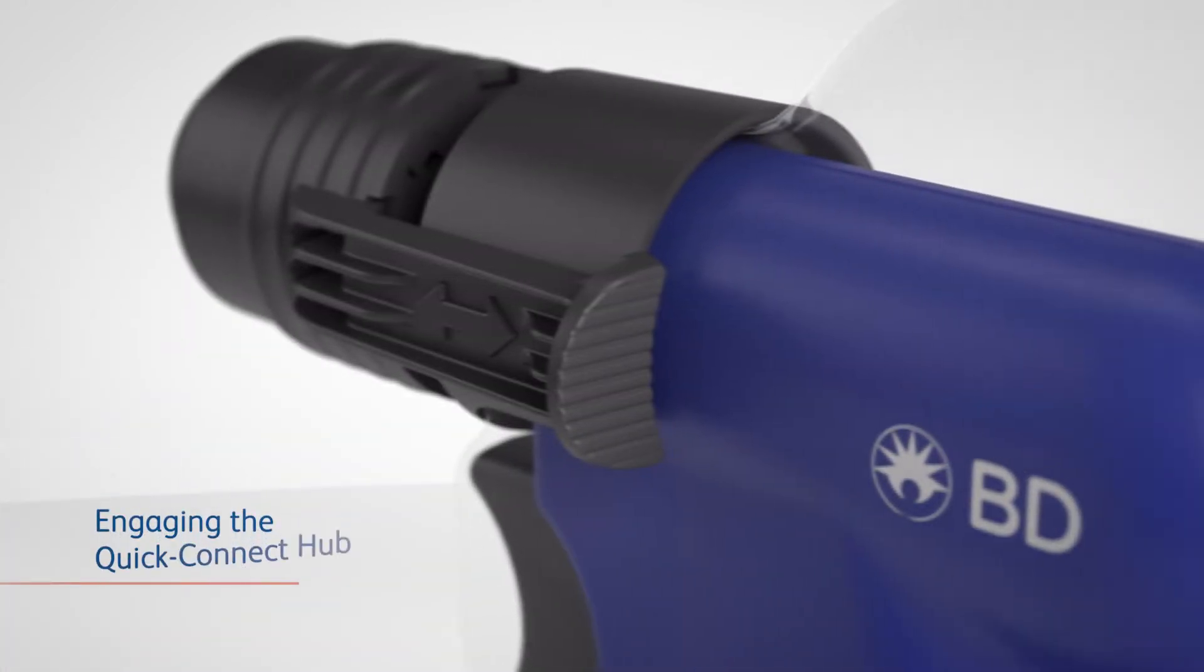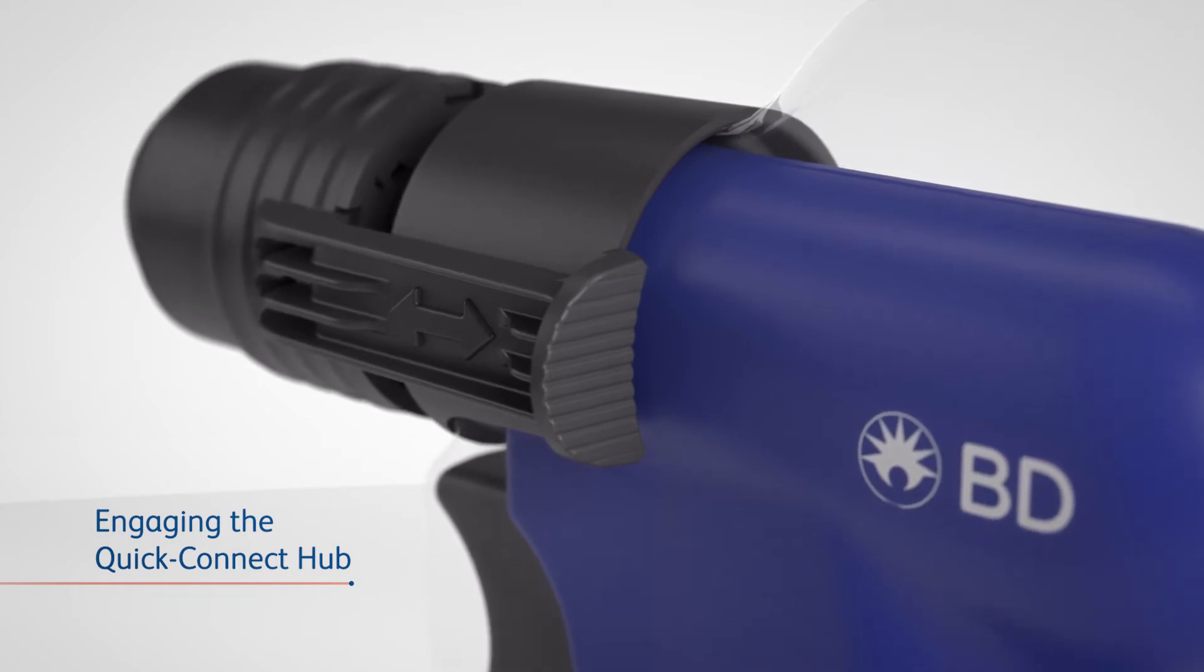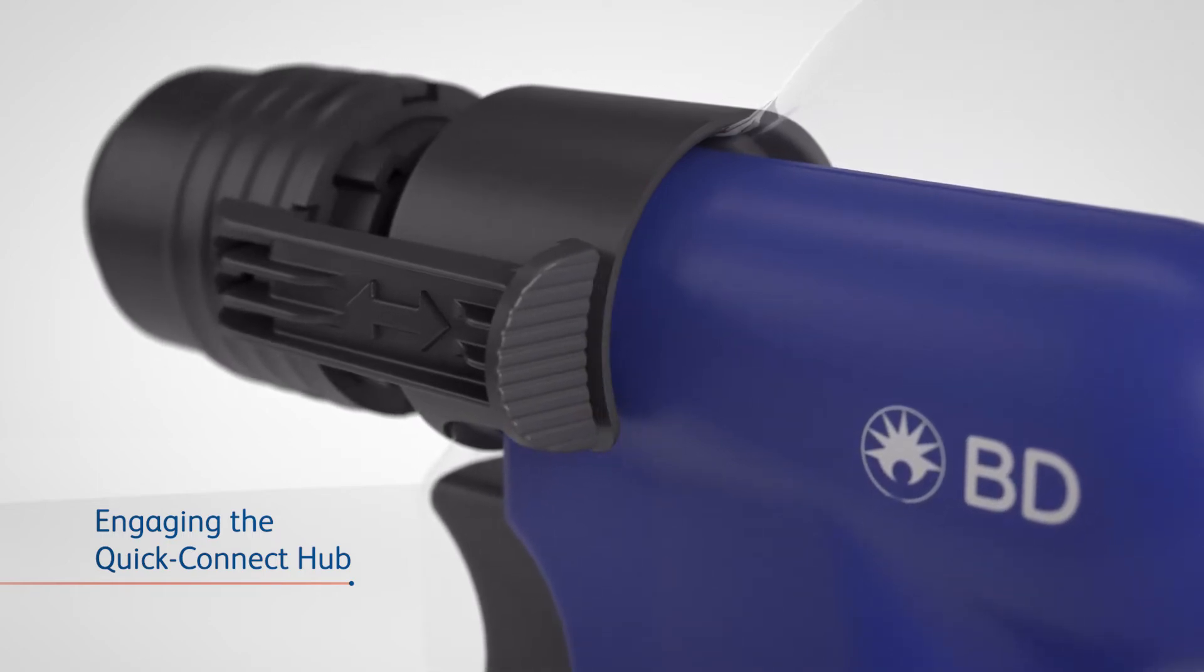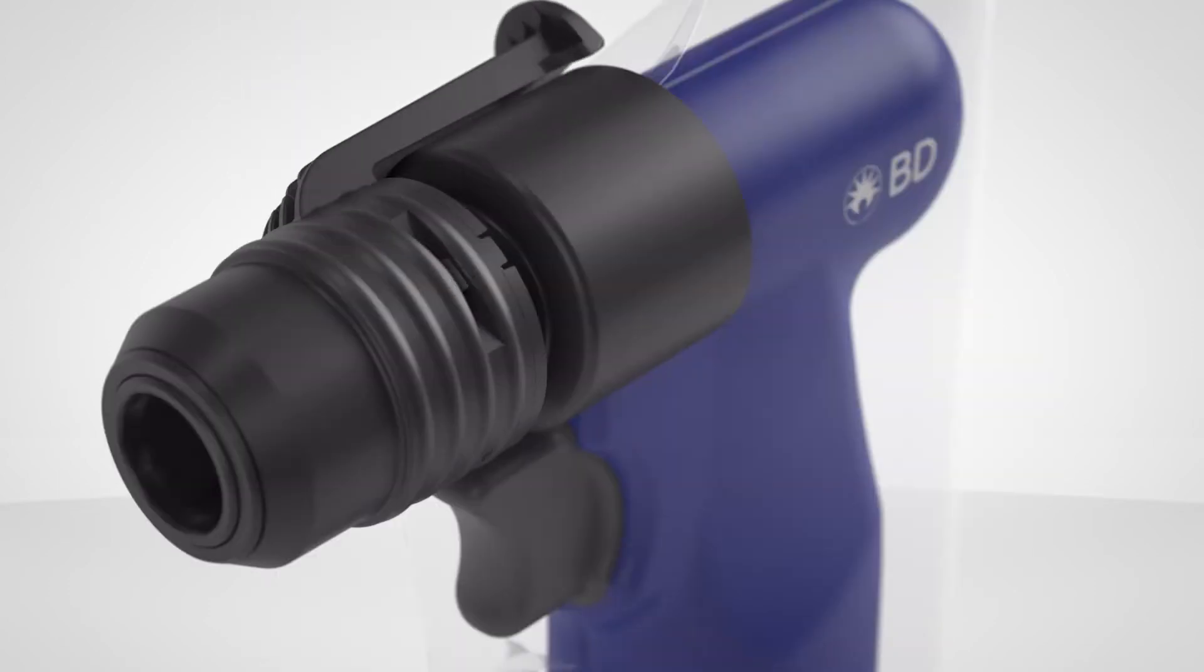The Quick Connect Hub allows for easy needle connection and disconnection. Simply push the release arm forward with your thumb. The release arm can be rotated for left-handed or right-handed use.